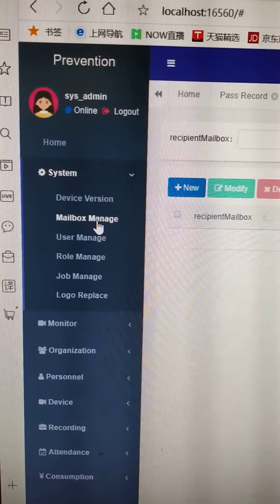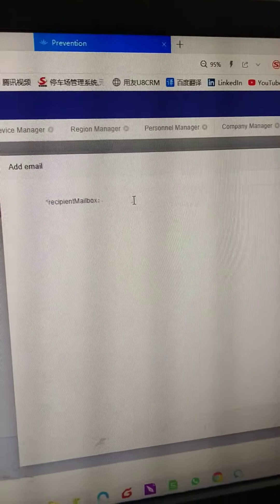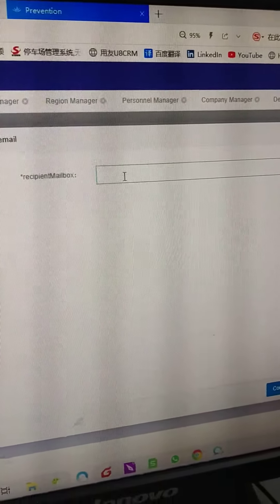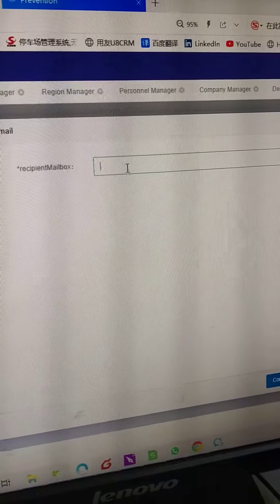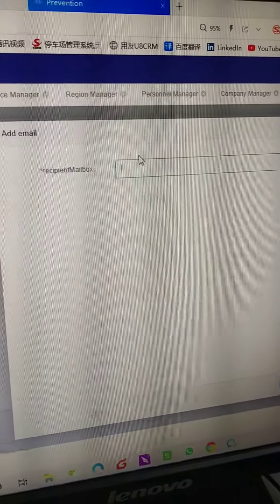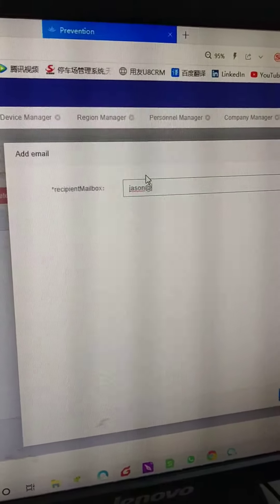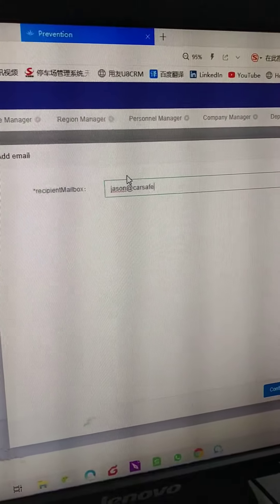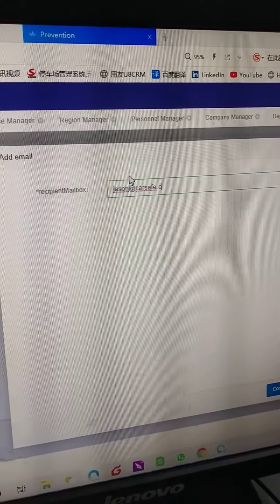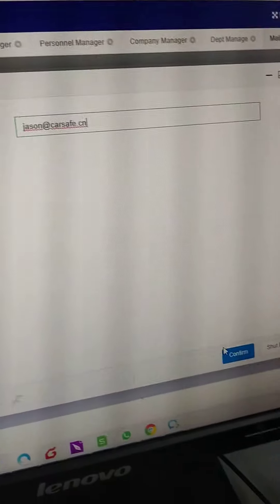Press the mailbox. Press new. Input the email of the administrator. Press confirm.